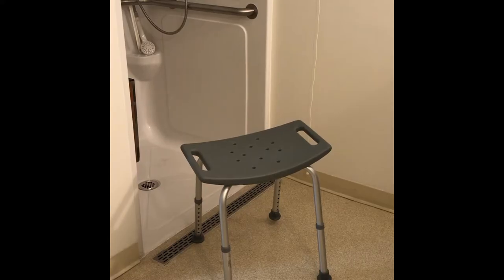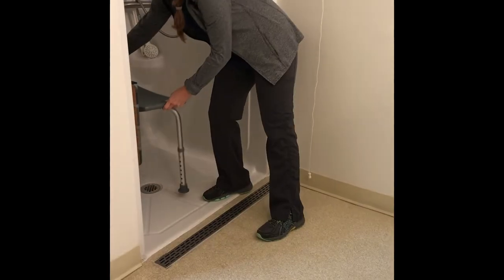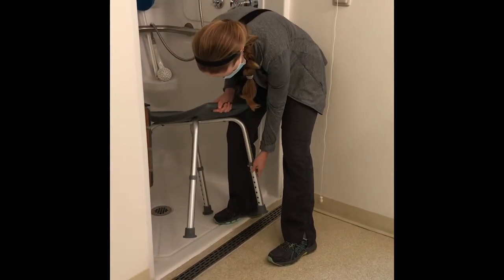The shower chair should be placed inside the shower facing the shower head. Your caregiver should help you adjust the legs of the shower chair to at least the height of your knee or taller.